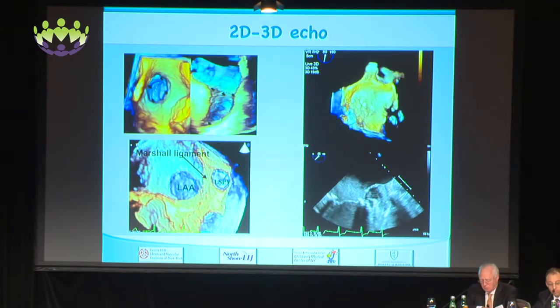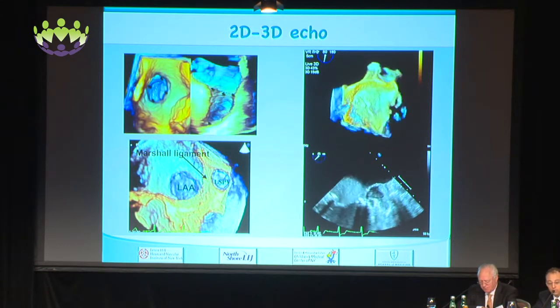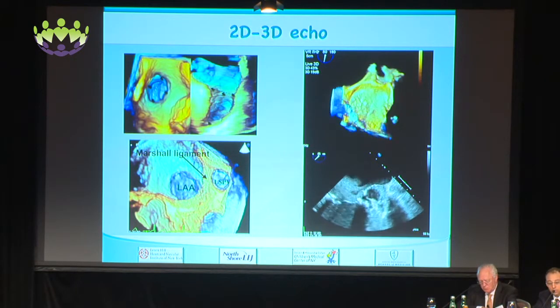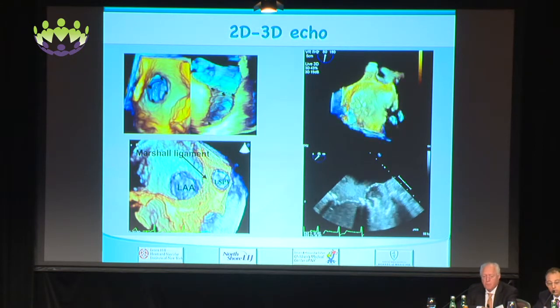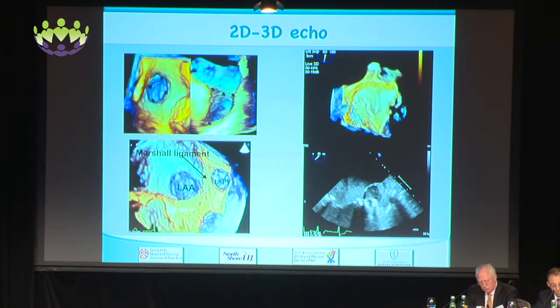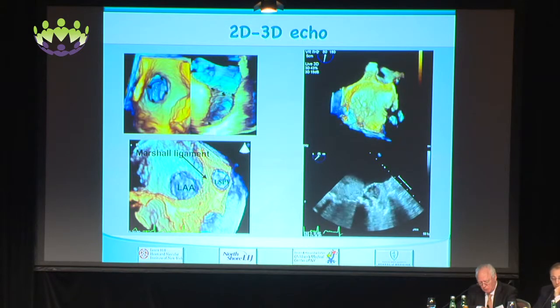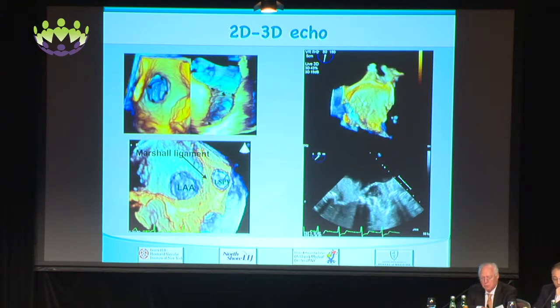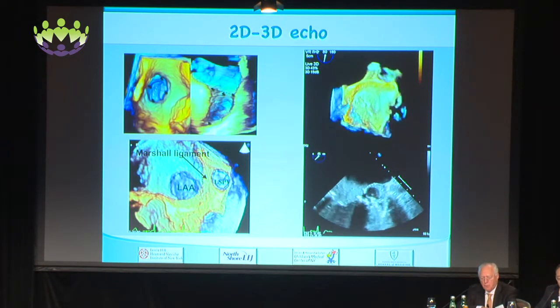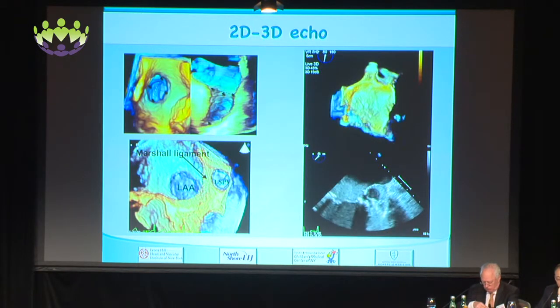But you saw the talk from Nina Wunderlich on all the qualities of the measurements from using 3D TEE. And on the right side of the panel, you can see, again, one patient that had a post-closure using the Lariat device. And you can see the hole of the opening that was remnant from the closure, confirmed by contrast echocardiography, that there is flow and the presence of a clot. So imaging becomes absolutely fundamental.